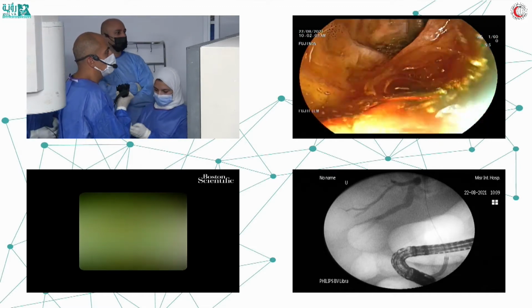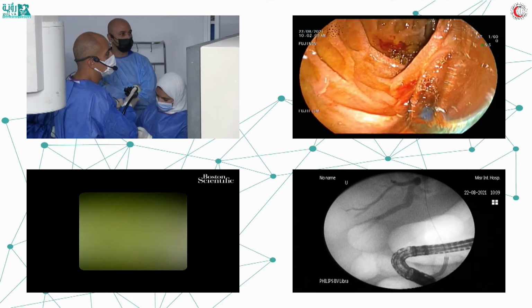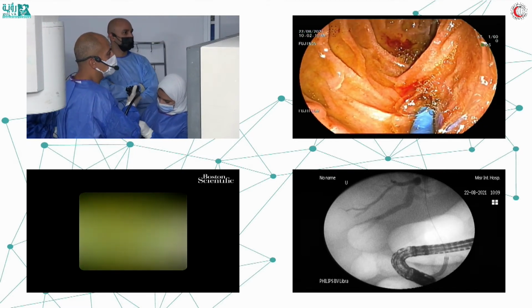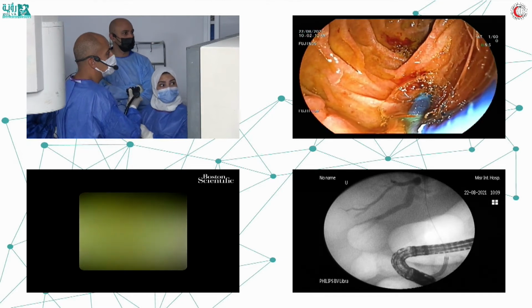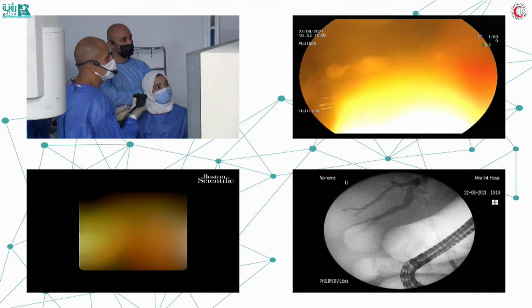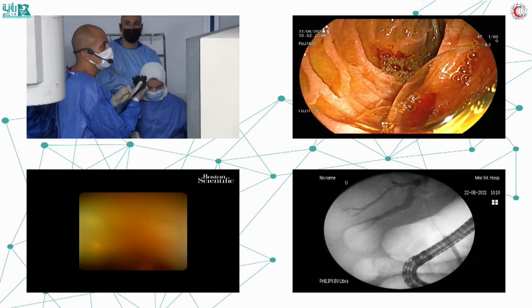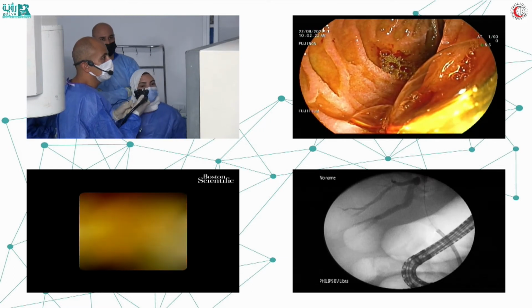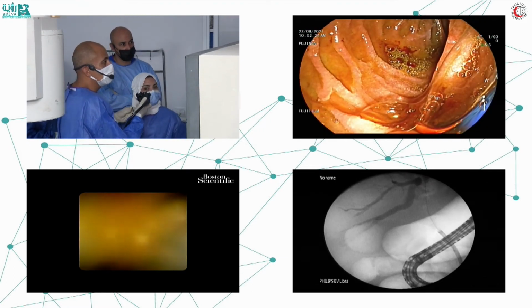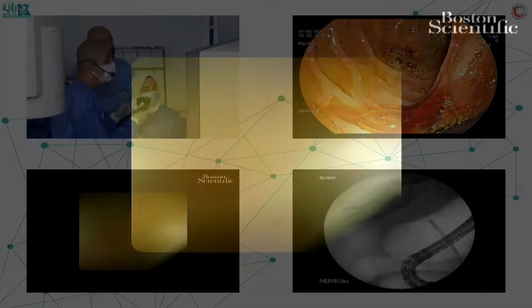So first of all, you should not use a lot of the elevator. Number two, think about using the big wheel, which is very important. You pass. Yes, I'm inside now. If you can shift to the spy image. Yeah. Yes, you can see the spy image. So I will go a little bit far now. I will ask, yes, whoosh inside the spy. Yes. Very good. Okay, stop.